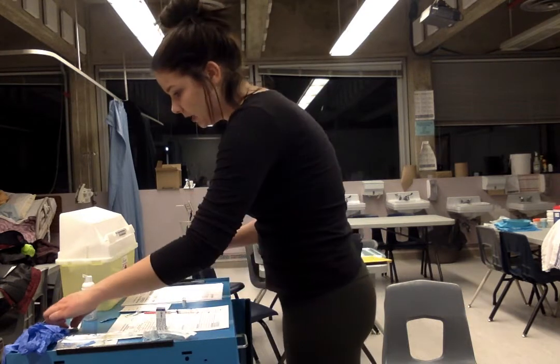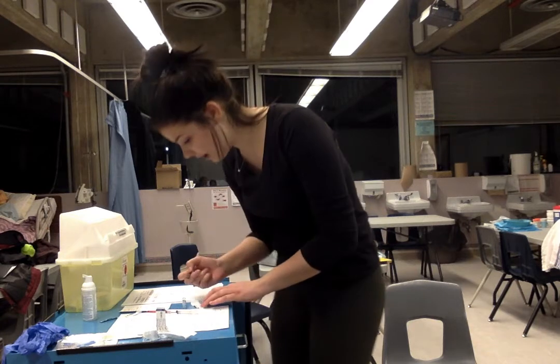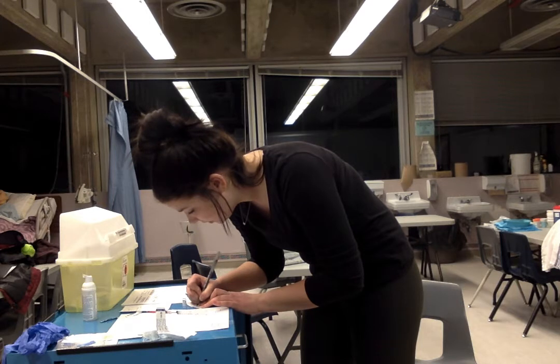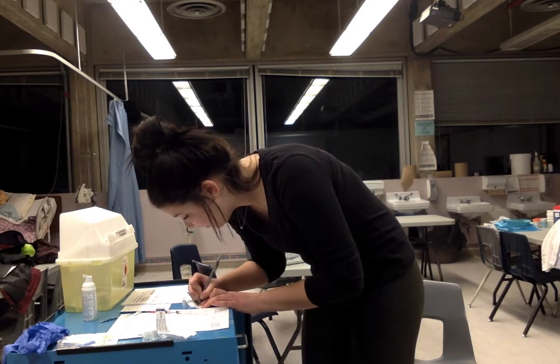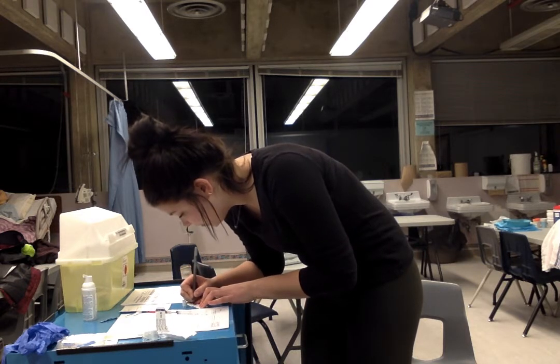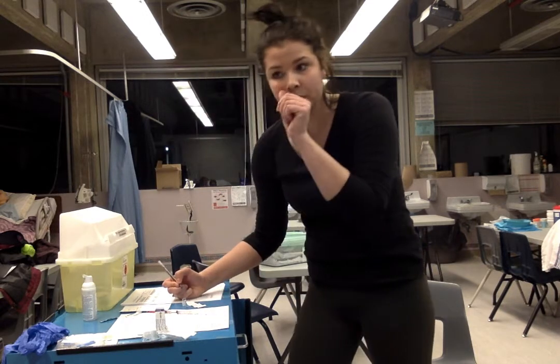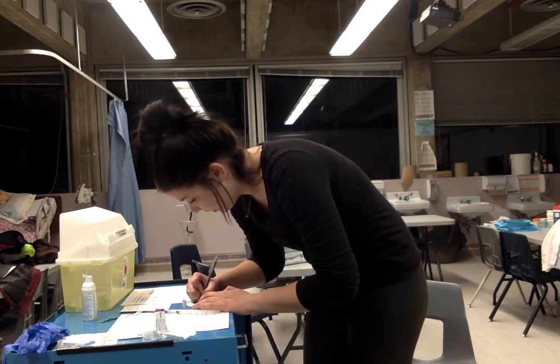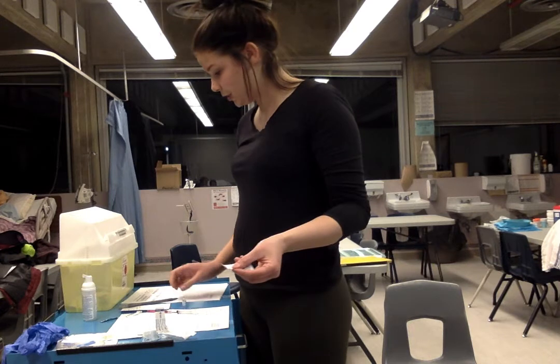Now I'm going to be making my label off of the ampule so that we have this for the line. It is January the 8th, 2020, and the medication is morphine. And then I'm going to be doing 10 milligrams per ml so that they know that that's the right concentration, because it does come in other forms. And then I will be signing my name. All right, so that's ready to go.